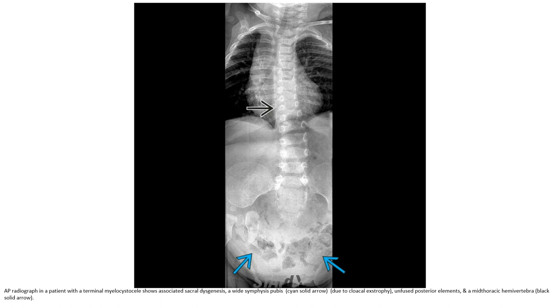This is the AP radiograph in a patient with terminal myelocystocele, showing associated sacral dysgenesis, widened symphysis pubis, unfused posterior elements, and midline hemivertebra.